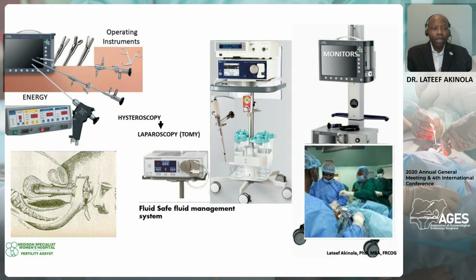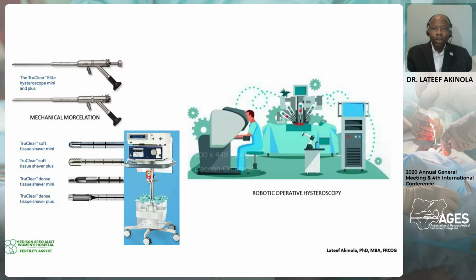it. Compared to the time when Pantaleoni was doing his own hysteroscopy, we have now modernized hysteroscopy: the monitor, the telescope, the instruments, the energy source, and of course the fluid management system. Everything is very modernized now, to the advantage of the patients and of course the surgeon. Robotic hysteroscopy is about taking off, and we are still awaiting further evaluation of the process itself and the procedures, to see whether it can be the gold standard for hysteroscopy in the near future.